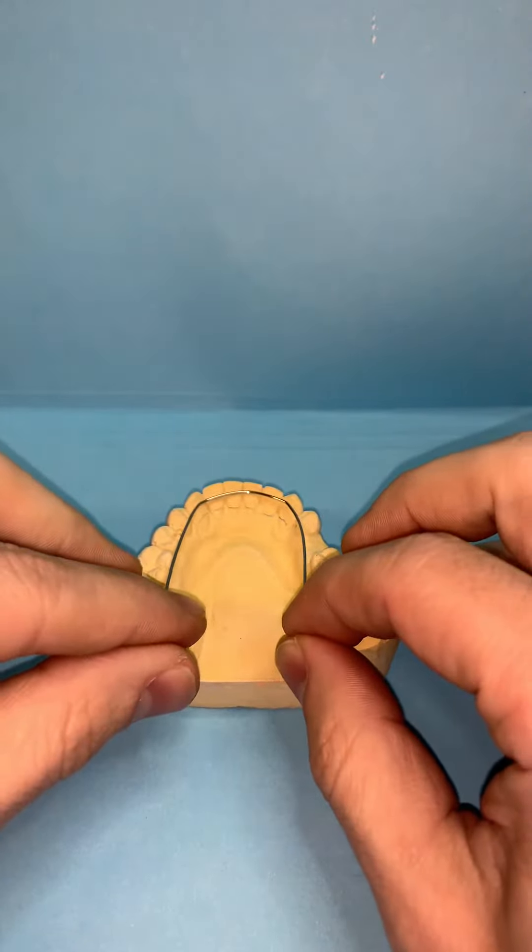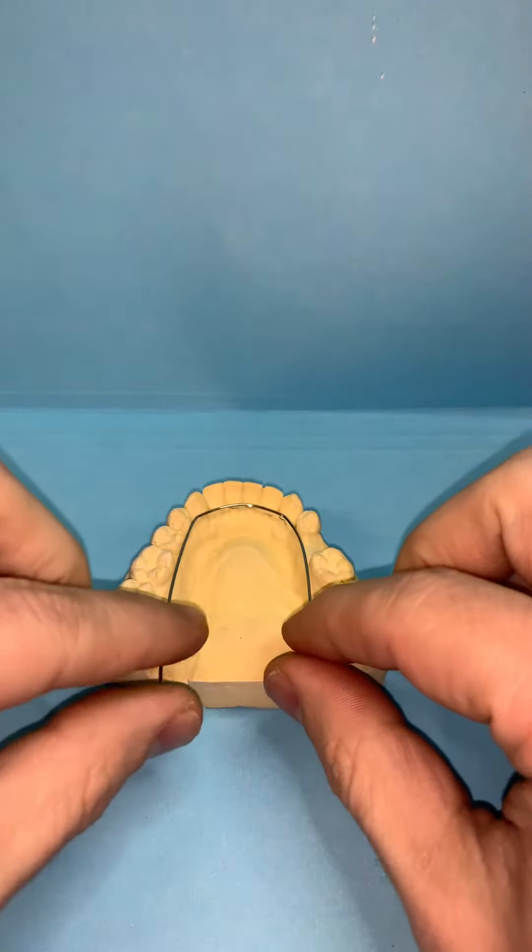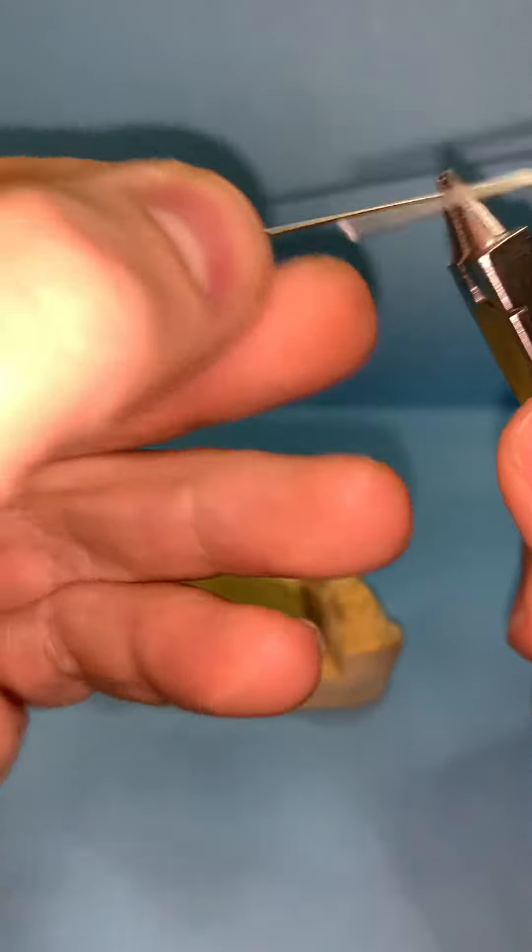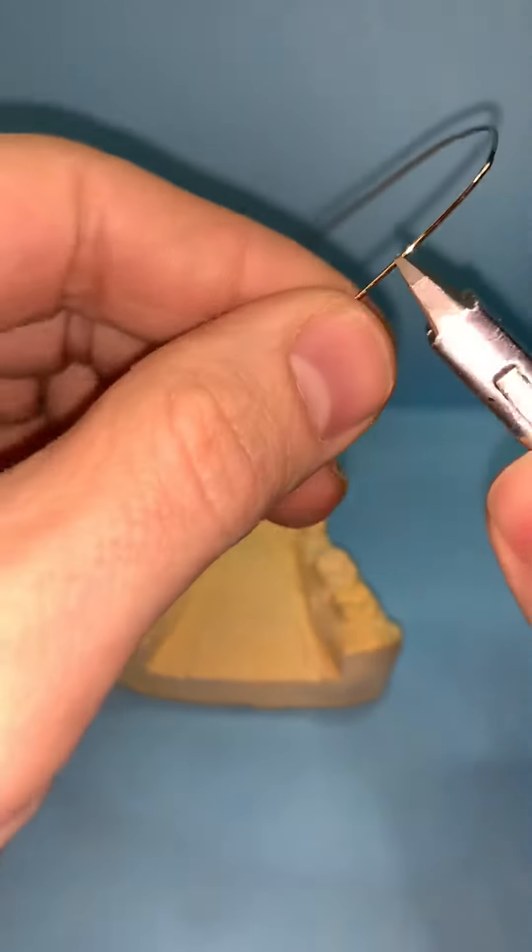If it was higher up, any pressure would make these teeth tilt forward. So as you bend back, you just want to contour it along the posterior teeth. Make sure it's touching the posterior teeth.